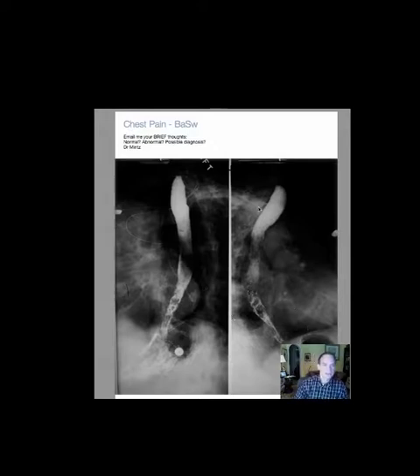So in this case, what do we have? Well, we have a barium swallow showing what looks like a pretty normal appearance proximally in the esophagus. Here, it looks like maybe it's abnormal, it's not filling well, but here it looks irregular. So we have poor filling with irregular margins. If you look here, you see an irregular border to the esophagus, and even here you have these little tiny outpouchings, a little hard to see, that could be small ulcerations.